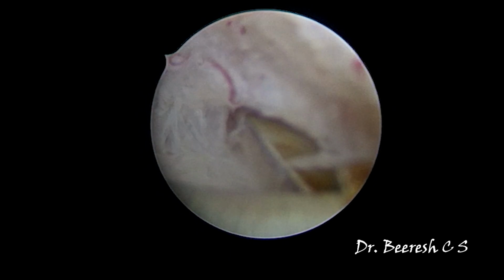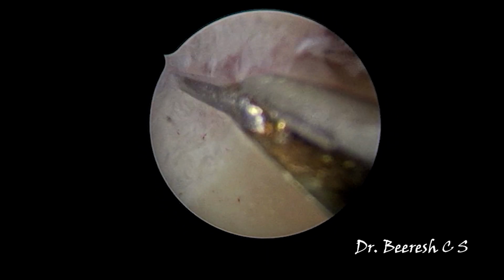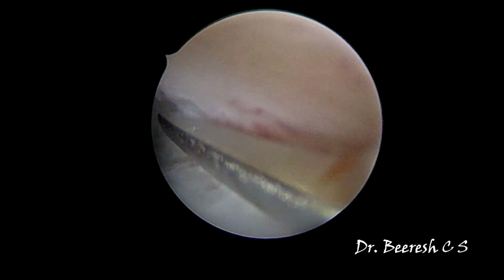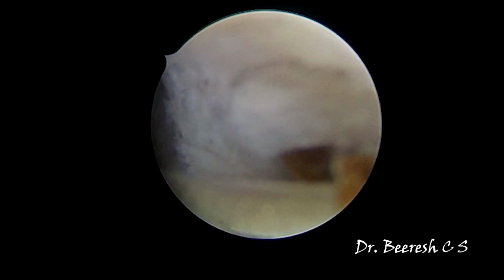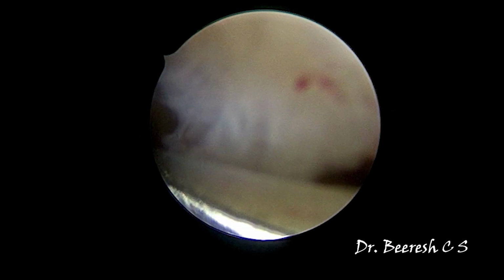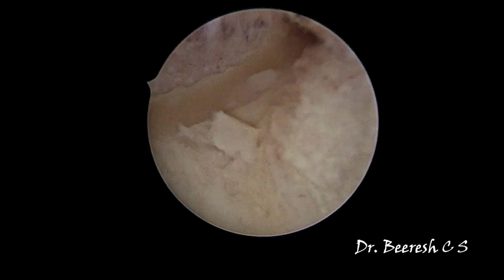The static jaw is insinuating into the tissues, and with the active jaw I am making small cuts and then slightly progressing the entire hysteroscopic operative sheath forwards with gentle cuts, trying to remain in the line of the ostial and the internal os line.